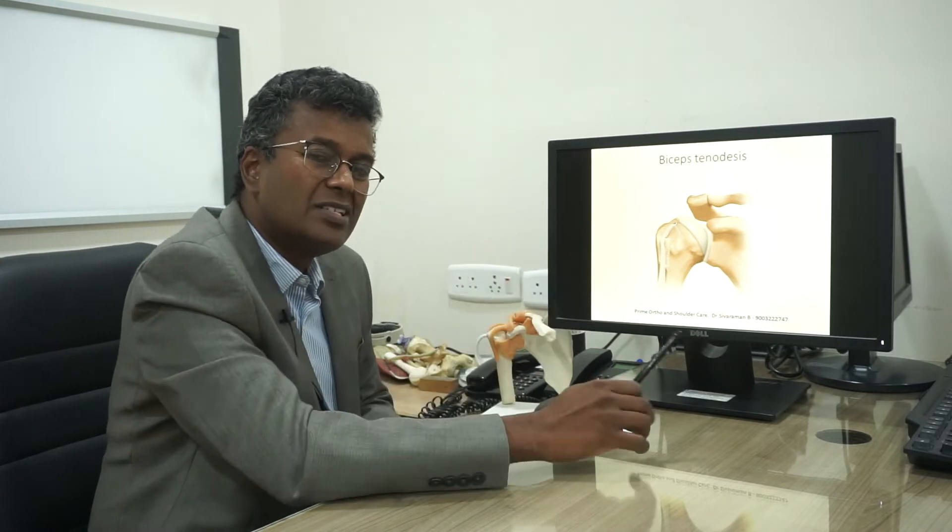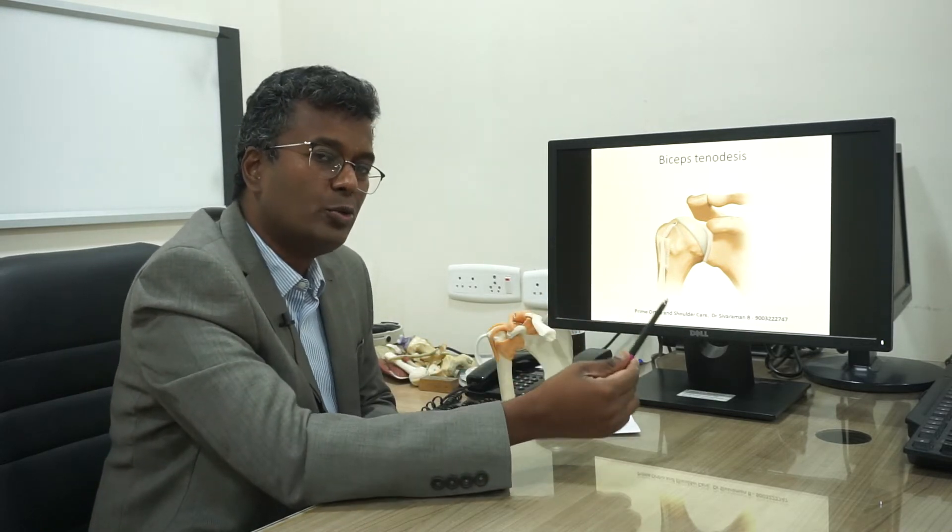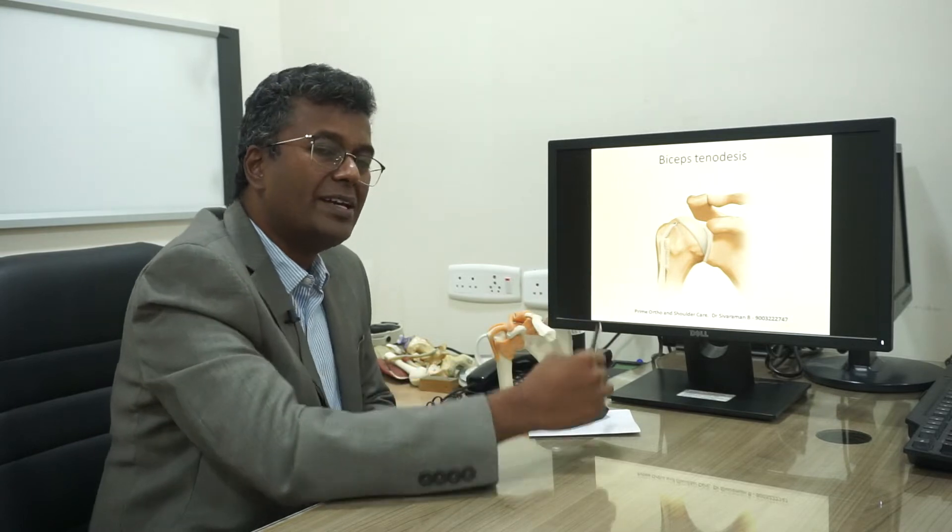For patients with biceps tendinopathy or a biceps problem, we attach the biceps back into the humeral head, which is called biceps tenodesis. If we simply cut the biceps, it is called a biceps tenotomy.